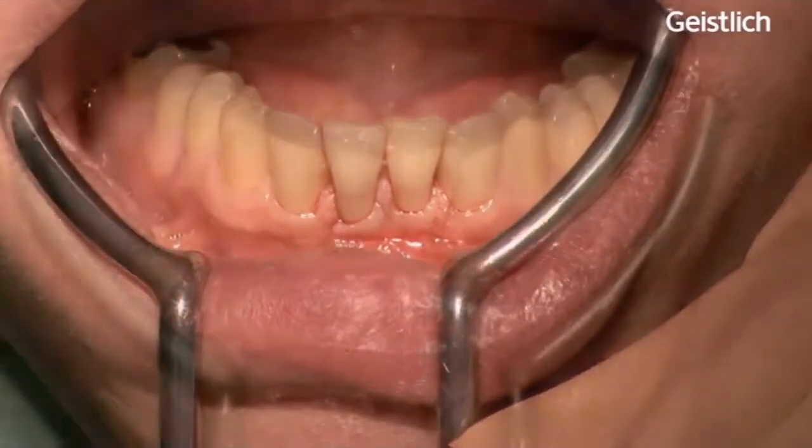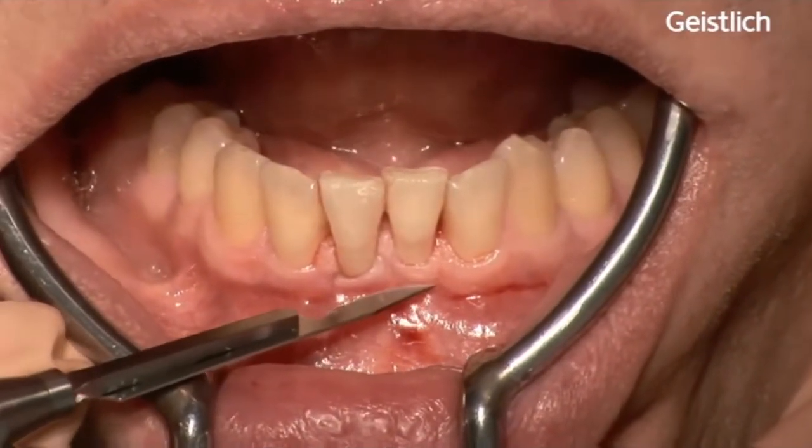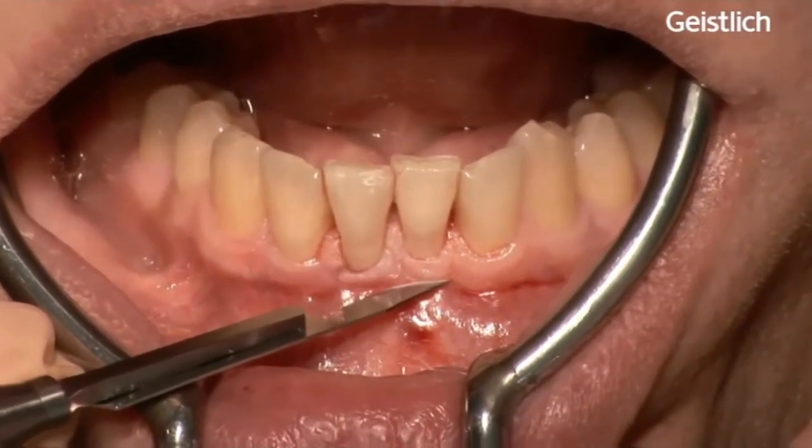Following administration of local anesthesia with Articaine, the surgery started with a horizontal incision just beyond the mucogingival junction.